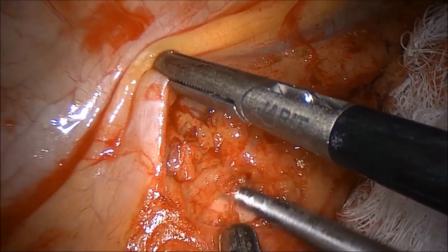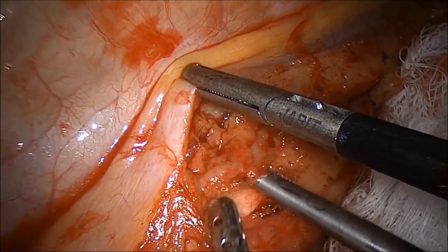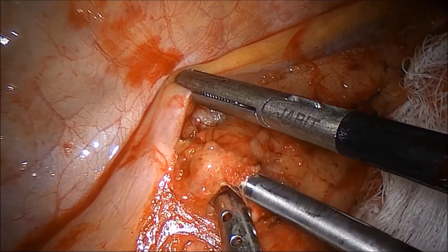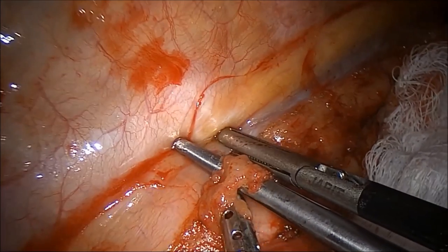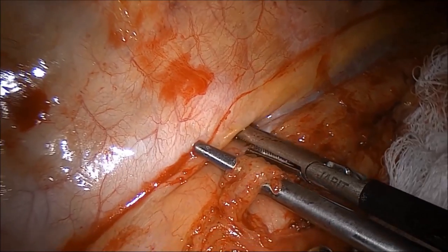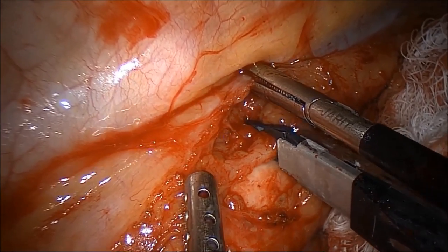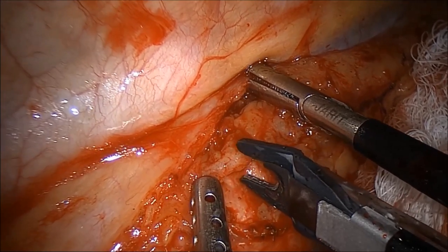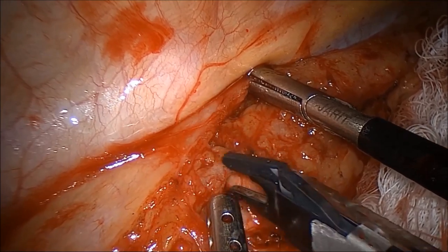The thoracic duct is carefully dissected below the level of the inferior pulmonary vein. Ligation of the thoracic duct, which is thought to help prevent chylothorax, is then performed with ties or with endoclips, as shown here. A right-sided chest tube is placed before repositioning.